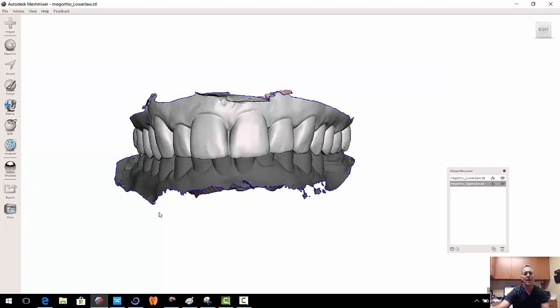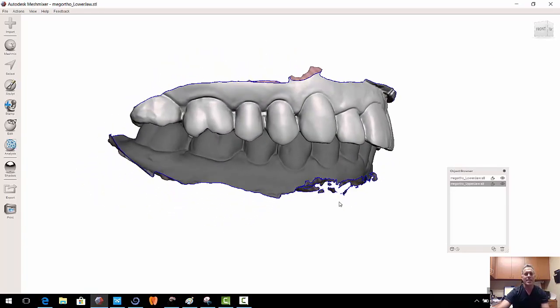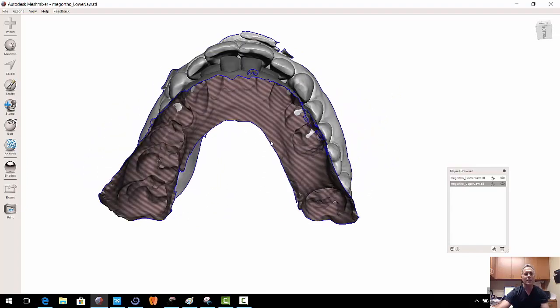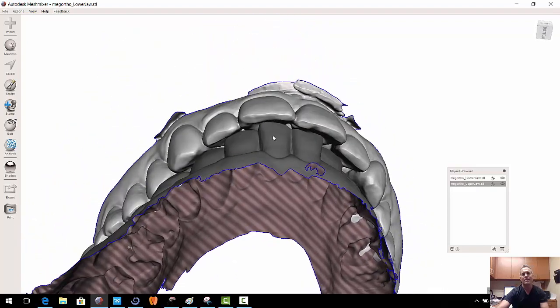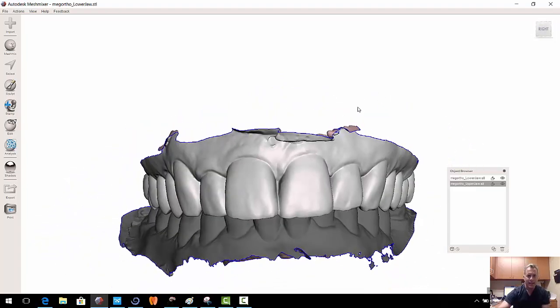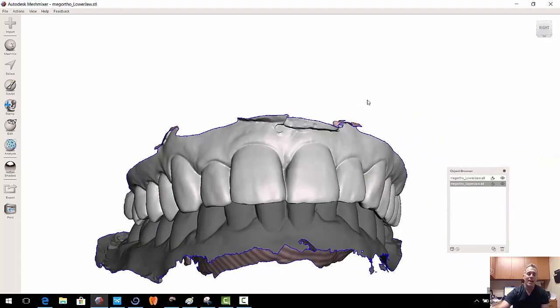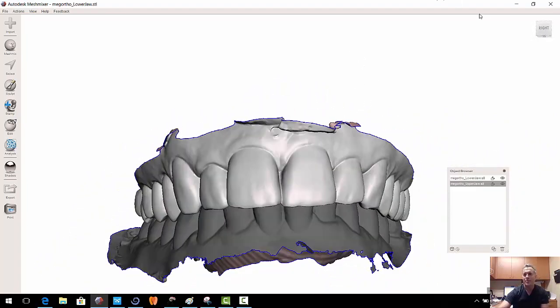So I'm just going to pull up Mesh Mixer. This was a CRX scan of a really nice patient. She has generally really nice teeth. She's Class 1 canine, Class 1 molar. She just has some issues in the anterior. So if we look in the front, we've got her number 24 and 25 have been pushed forward, which in turn are pushing 8 and 9 out. Her chief complaint is that when she smiles, her 2 front teeth stick out a little bit. So we're going to go ahead and play with the software and figure out how we're going to treat this case.